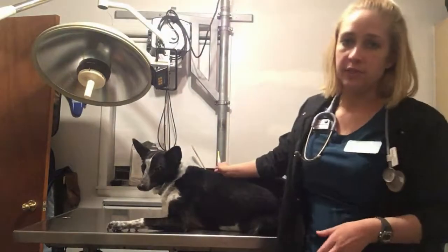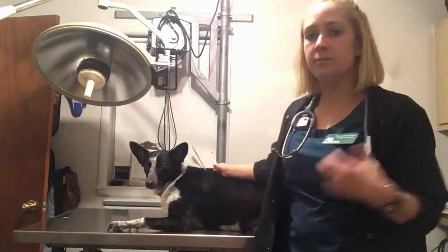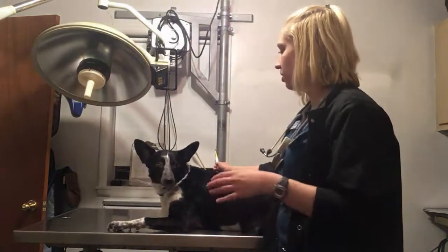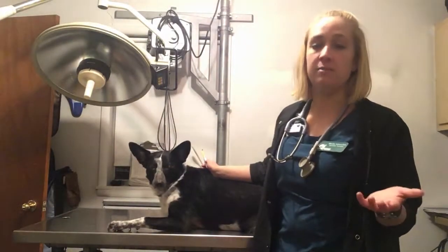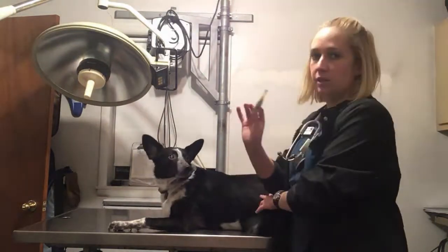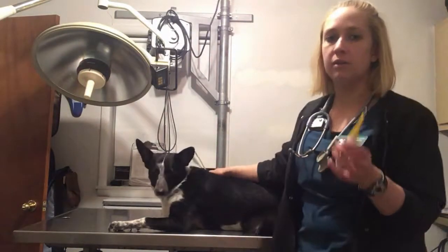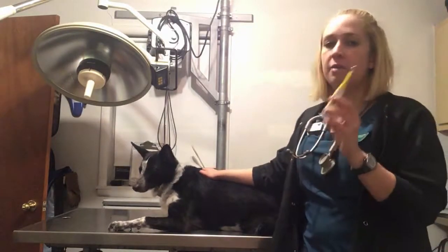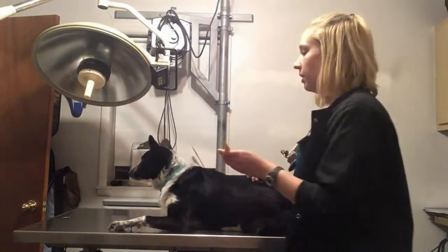Okay, so when you are doing the physical exam, the main thing that you are going to be doing is a TPR and auscultating the heart and lungs. The first part of TPR is going to be temperature. So we're going to get a thermometer, and we just have a regular thermometer here, and I'm going to insert it rectally. Do make sure you have lube, plenty of lube.